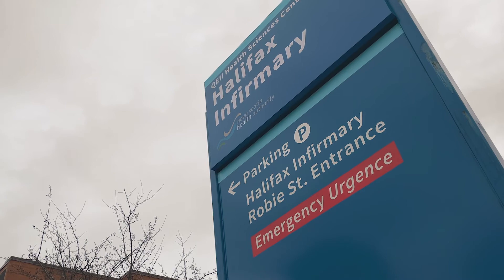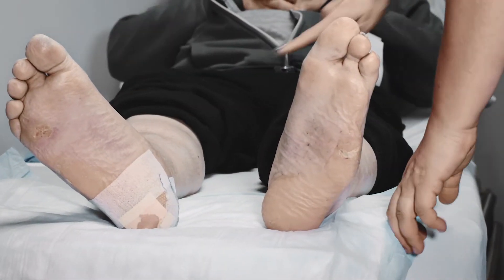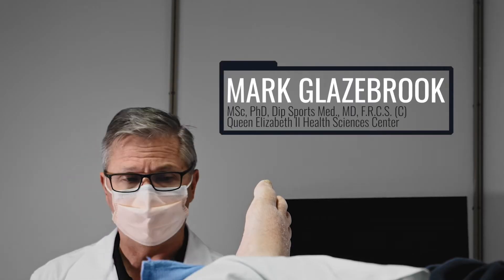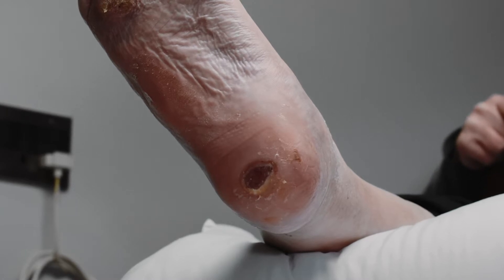We have a 55-year-old male here who has diabetes and he has the classic diabetic ulcer. We're choosing Dermagen, which is an excellent option to try to enhance healing, to speed this process up and return people to an enjoyable working lifestyle.